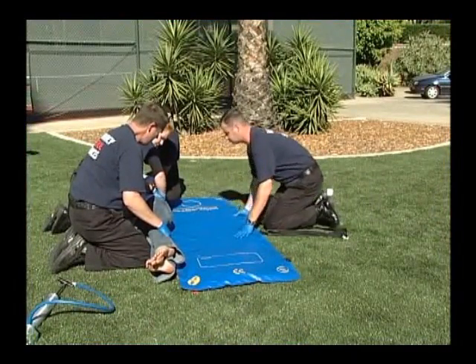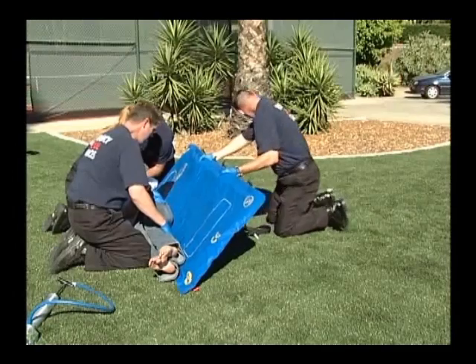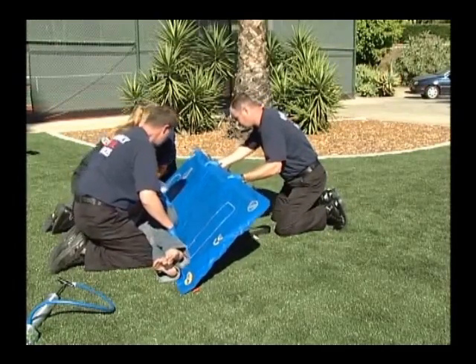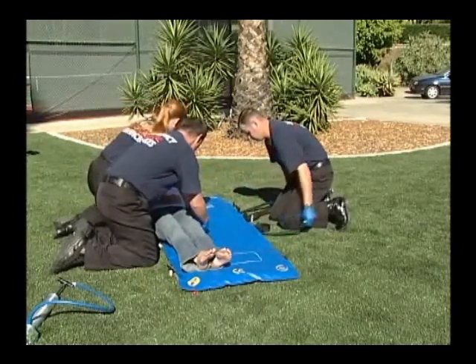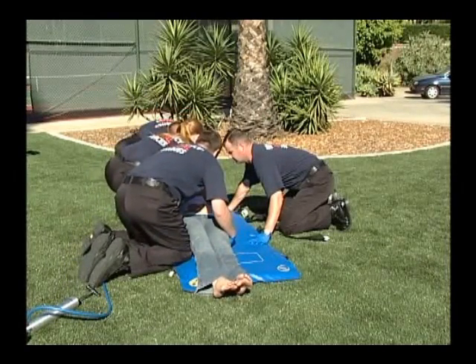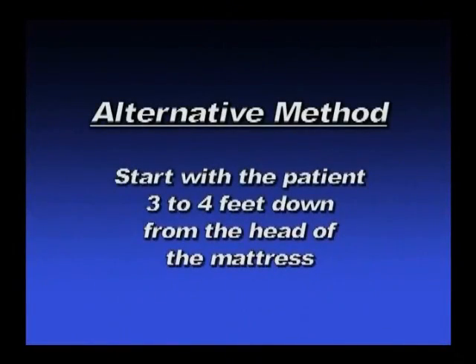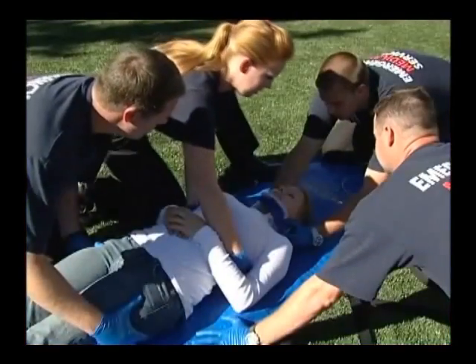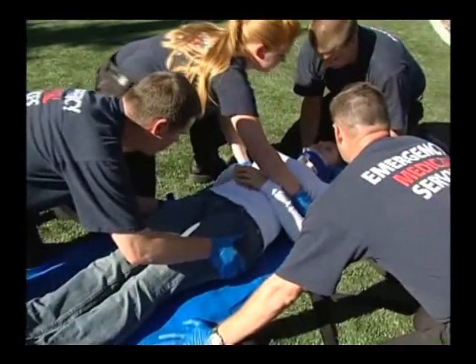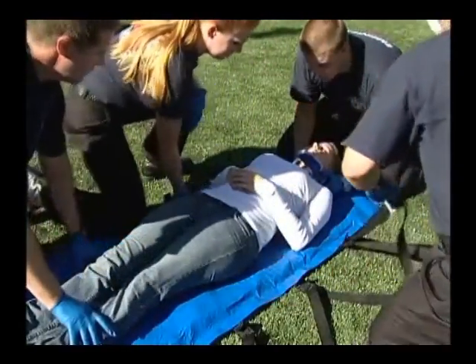After checking the patient's back, log roll the patient back onto the mattress. Center the patient if necessary. You may find it easier to log roll the patient under the mattress with the patient's head three to four feet down from the head end of the mattress. You can then move the patient along the long axis of their body into a position that is centered on the mattress.